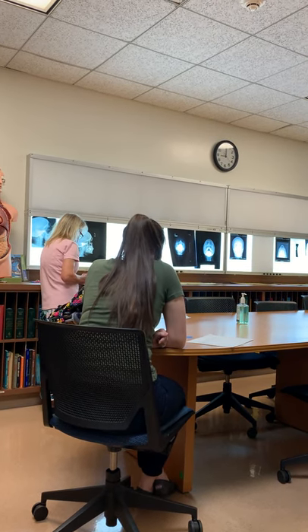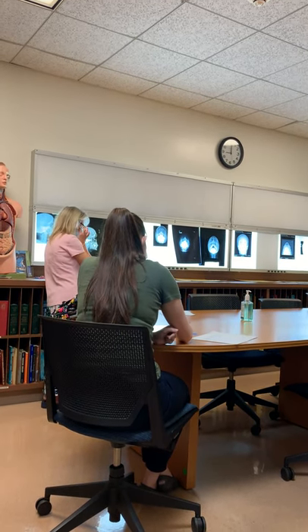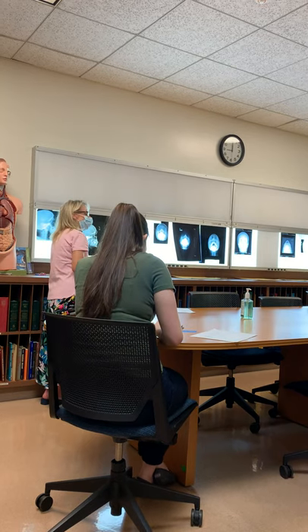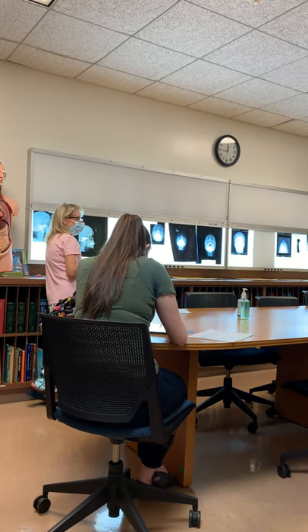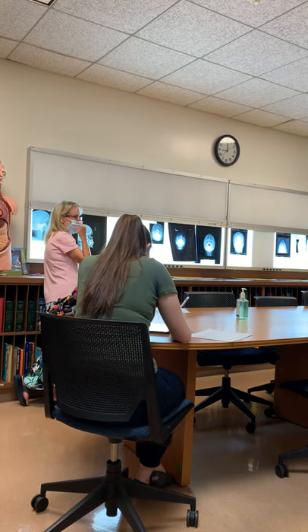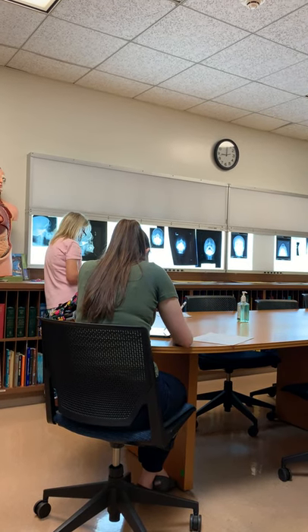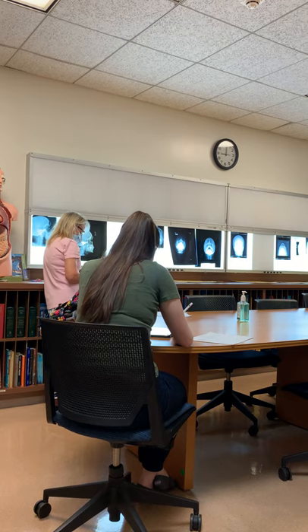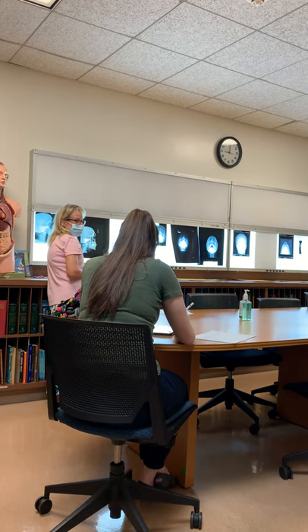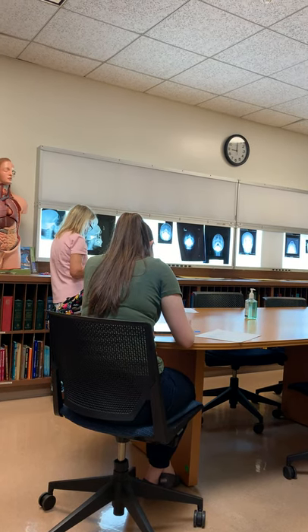Okay. Blowout fracture. What's a blowout fracture? Direct blow to the eye. Good. So the globe of the eye blows a hole in the floor of the orbit, which I've seen on registry. You say the roof, no, it's the floor. Remember, know that it's best seen in the Waters. If you're taking the test and you don't know which projection, pick Waters, because it's considered the money shot of the facial series. You can see about everything.